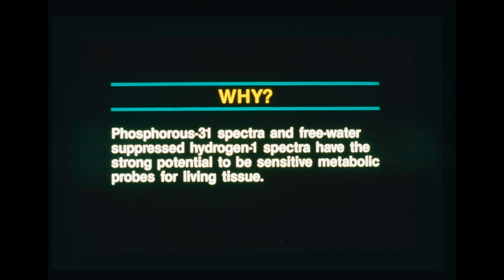First and foremost, we have to ask ourselves, why are we even doing this? The main reasons are that P31 and free water suppressed proton spectroscopy may yield some information about what's going on within the body. In other words, increasing the specificity of NMR, which is something that we kind of lack right now from the normal aspects that we use it for.